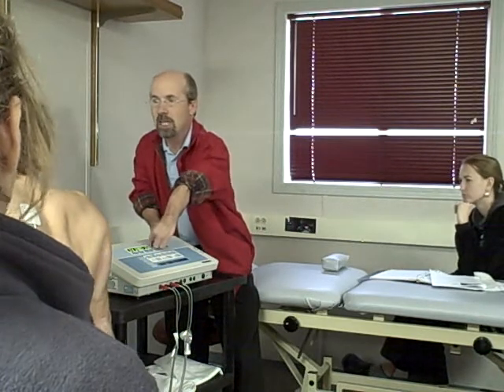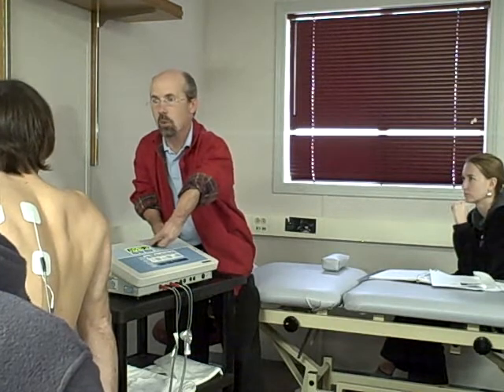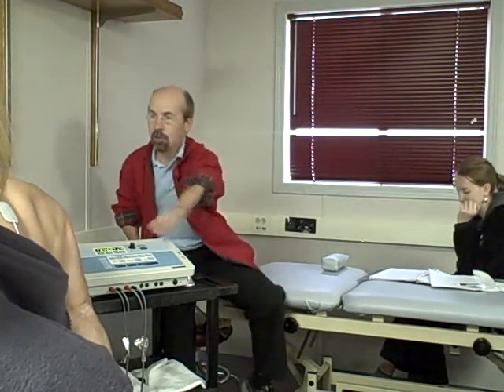So this is your fine-tuning feature. It's like a teeter-totter. You're actually not changing the overall intensity. What it's doing is going to the different electrodes. So you open the balance feature and then you start turning the dial. You do it yourself to get a feel.